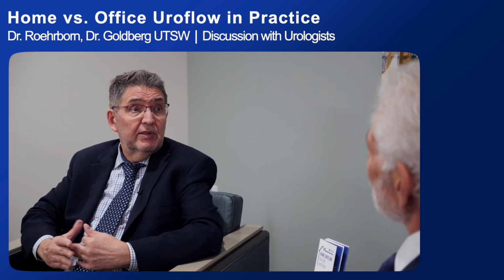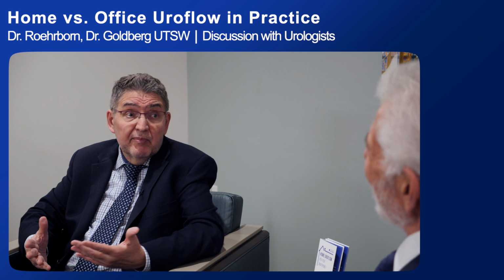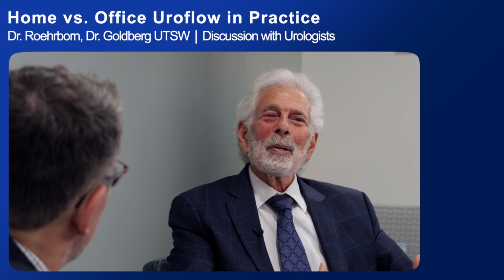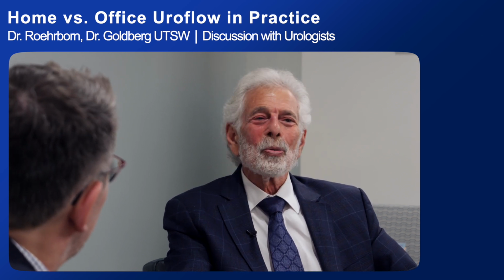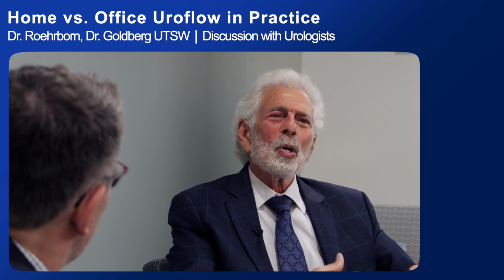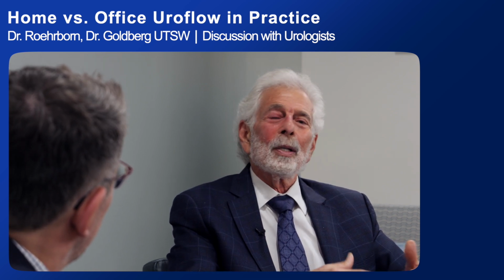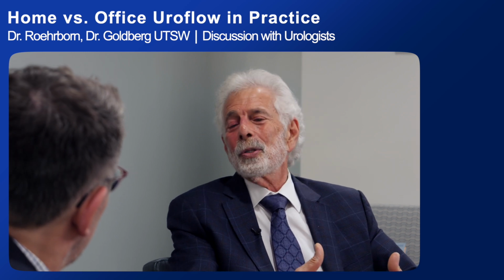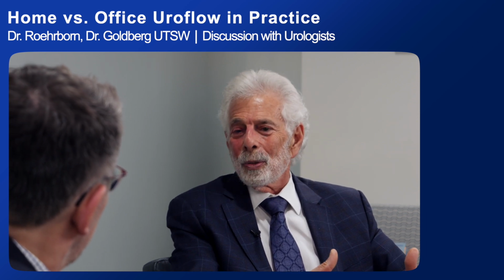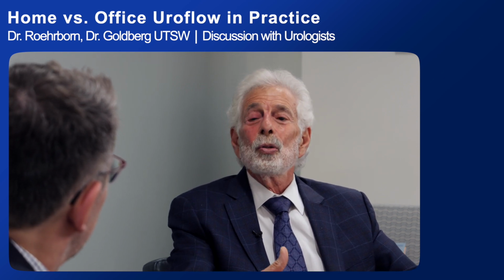What about medical therapies? So many men are taking alpha blockers, 5-ARIs or combination therapy. You have men on anticholinergics. Do you check the flow rate together with a residual urine? We would be tying up 2 bathrooms continuously, trying to do that, waiting for them to go, cleaning up the messes in the bathrooms, and so forth. So it isn't practical, certainly, to do it. It would be nice to give a man an OAB drug and say, let's check your flow and see how you're doing. 1 alpha blocker tablet isn't enough. Maybe you should try 2. The PDE5s may help. Let's see, but there just isn't the practicality to do that.